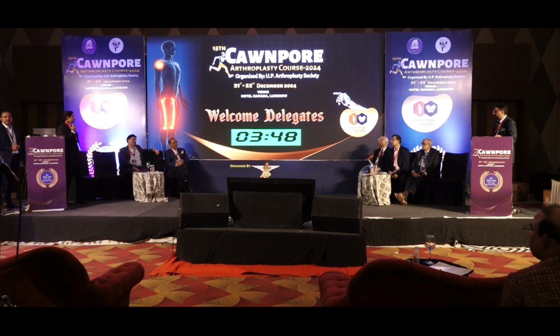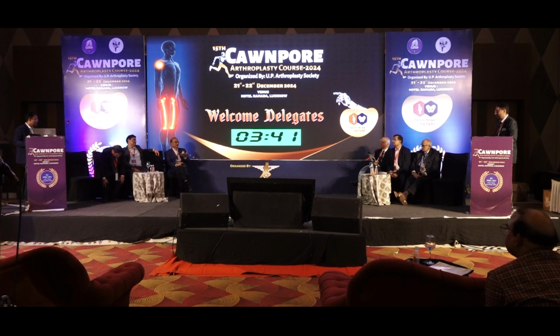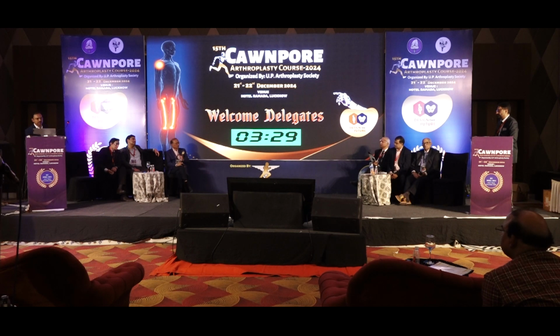I'm the reverse practitioner, because I started my journey in the 90s as a CR knee surgeon. This is what I was trained in. There were 3 years when I was basically a CR surgeon, but I was forced to do a PS knee because I was not getting a correction. And those were the times, I'm talking about 2001, 2002, when the knees were bad.